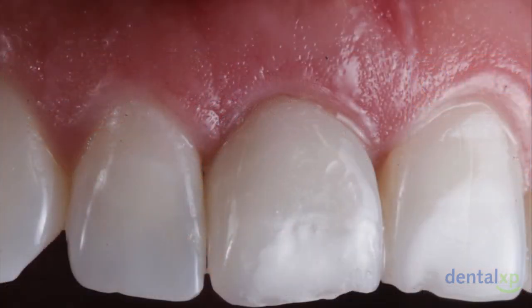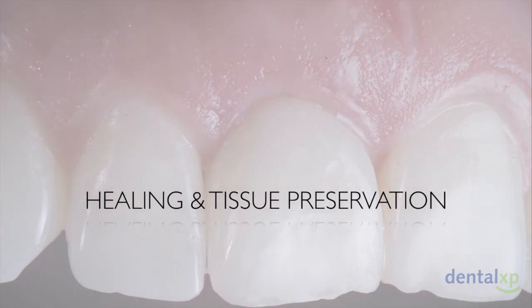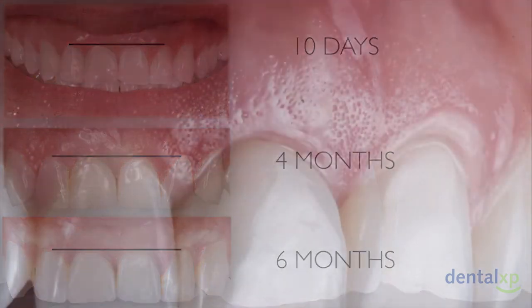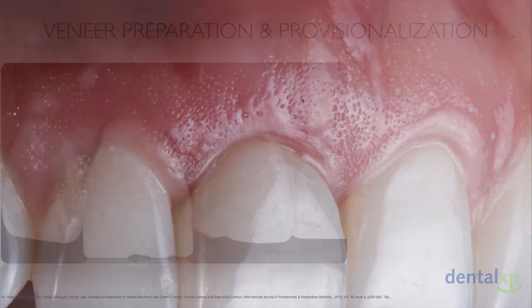And if we look at the healing at 6 months, you could appreciate the quality of the tissue around this implant and the maintenance of the tissue architecture as a result of the provisionalization. But also throughout the healing time, we're able to maintain the gingival margin levels with minimal soft tissue recession when compared to the adjacent central. And again, a close-up view of the healing at 6 months, you could appreciate the stippling around this implant and the health of the tissue in this area.